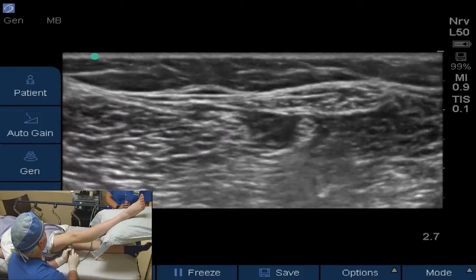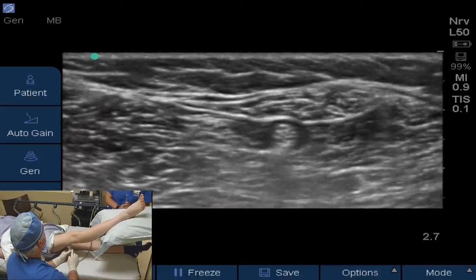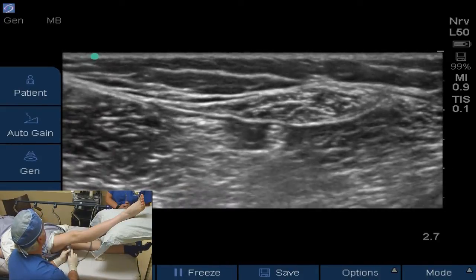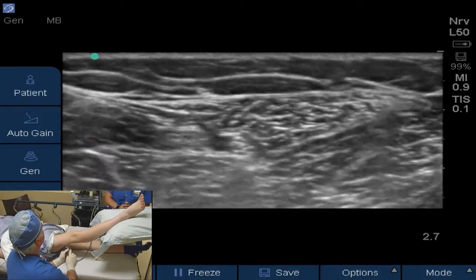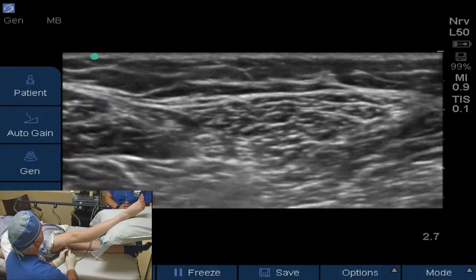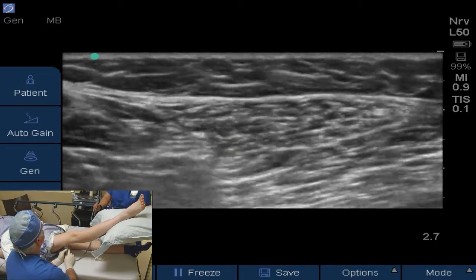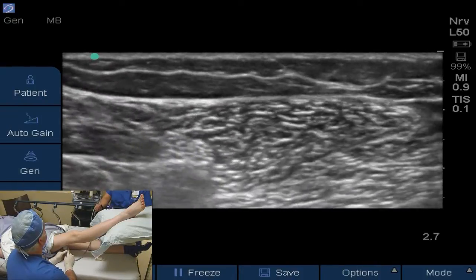The problem with this block, as you can see here, is that these nerves look like muscle and you have to be very careful and keep a good eye on them. If you've got an athlete with low body fat like this young lady, you have to really keep a close eye on those nerves and not get confused and lose them in the muscle. We can see them right there coming together, really surrounded by muscle and really close together.